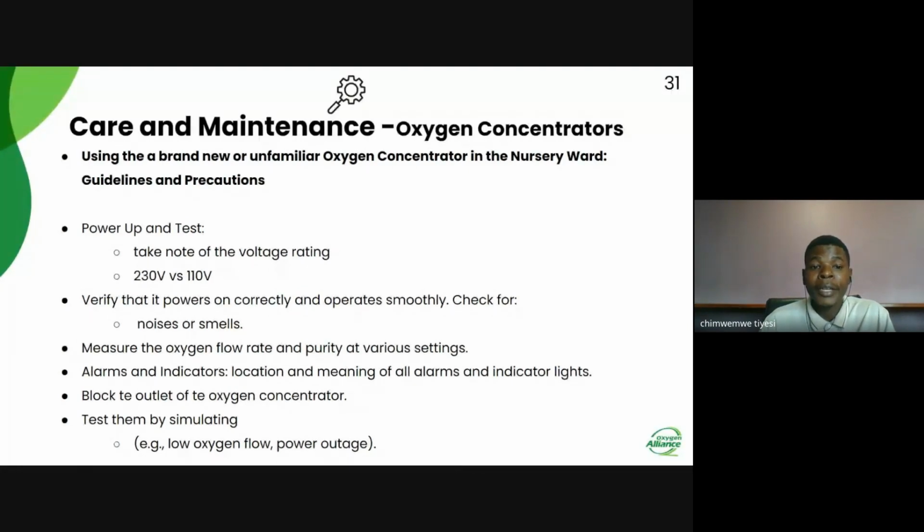You may actually get low oxygen purity compared to what you would get with the 110 volts at 60 hertz, the one it was designed to work at. So pay close attention to that. Also verify that power is connected correctly and also operates smoothly.